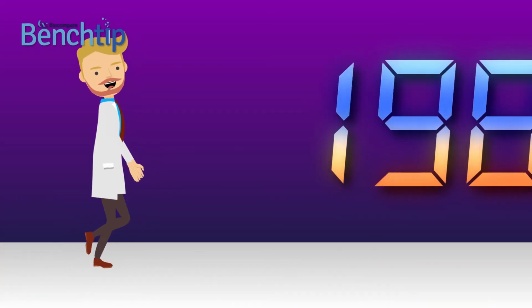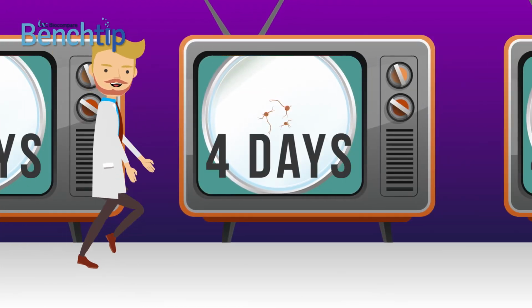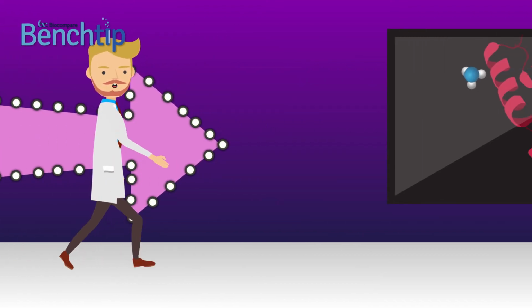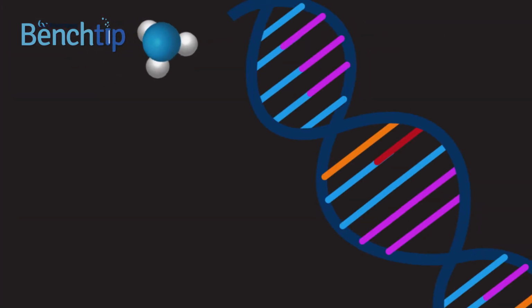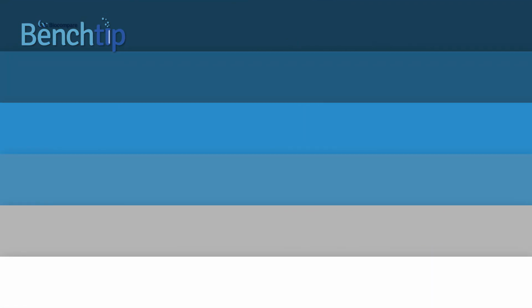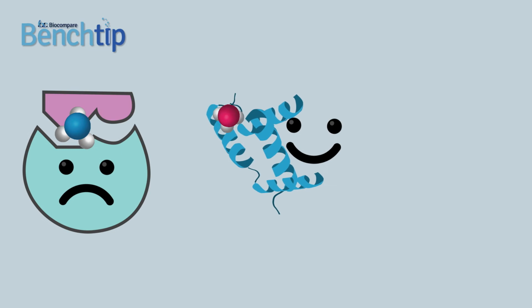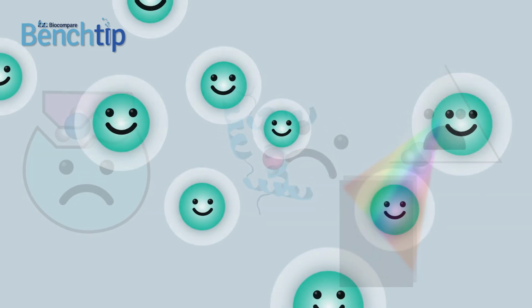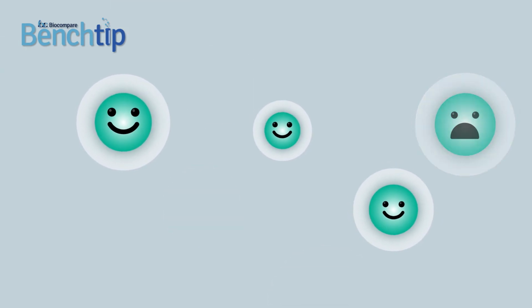As long ago as 1980, researchers noted that neurite growth slowed or stopped after 4 days of culturing in plastic dishes. Since then, we've learned that leachables can bind to proteins or DNA, thereby interfering with observed interactions among proteins, genes, drugs, and reagents. Leachables can inhibit or inactivate enzymes, disrupt the activity of proteins, and even interfere with spectroscopic analysis. And as we've seen, leachables can affect the normal growth of test cells and disrupt normal cellular function.